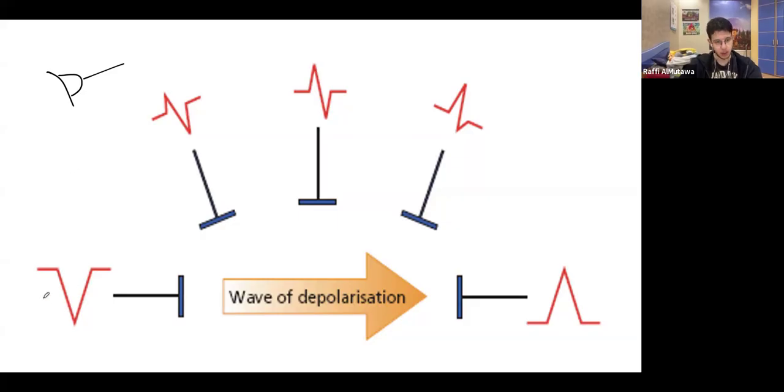Electricity can be negative or it could be positive. And this kind of correlates to the way that the heart moves. So when the portion of the heart gets closer to the lead, it's going to pick up a stronger electric signal, whether it be positive or negative.